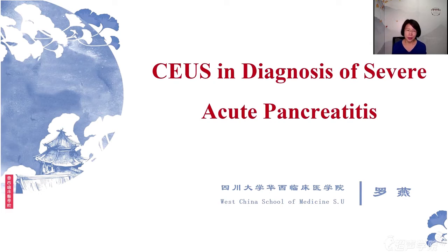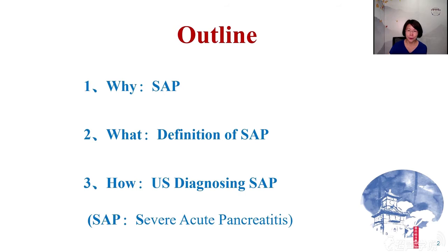Today, my topic is contrast-enhanced ultrasound in the diagnosis of severe acute pancreatitis. My name is Luo Yan, from West China Hospital. SAP means severe acute pancreatitis. My topic will be three parts: why choose SAP, what is SAP, and how to diagnose SAP by ultrasound.